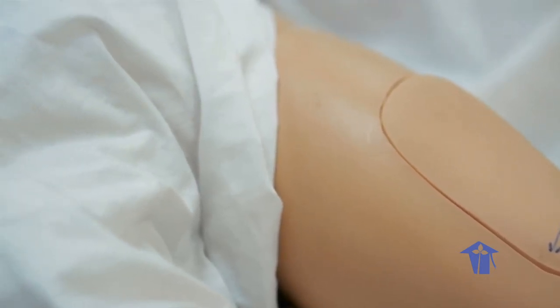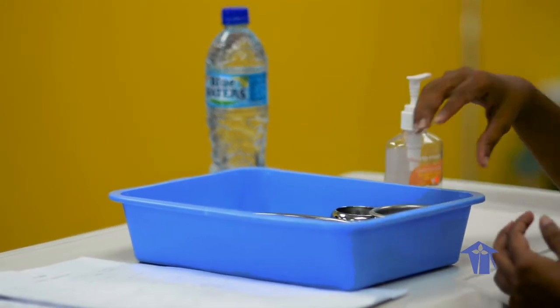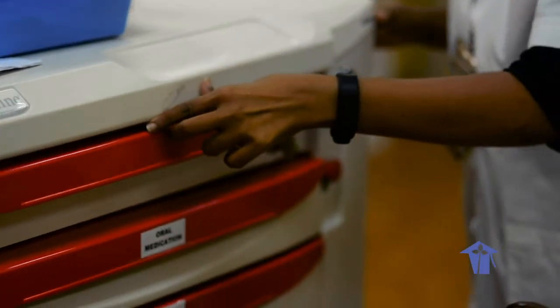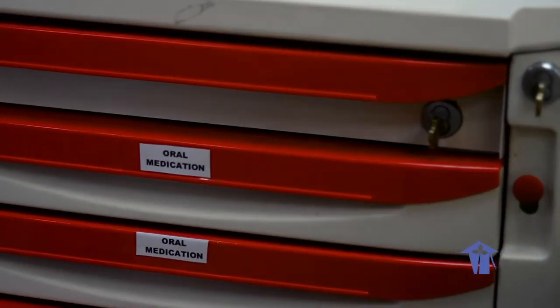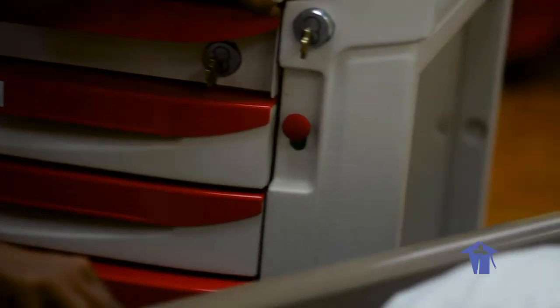Gather equipment: sterile syringe and needle, sterile swab, small gauze, doctor's notes, nurse's notes, and appropriate PPEs. Perform hand hygiene. Place the medication cart in front of the patient's bed, also making sure you are facing your patient at all times. Note: always prepare medication for one patient at a time.